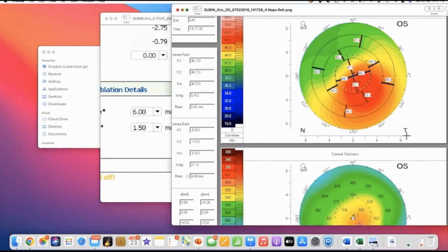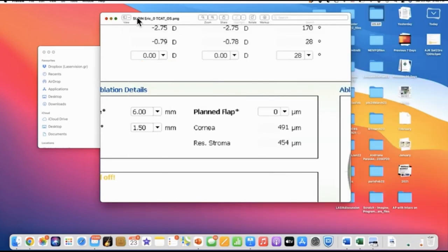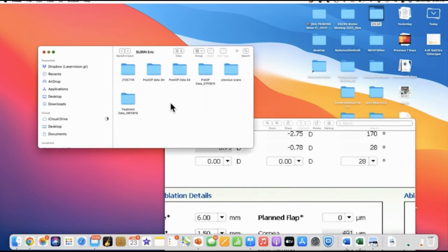How much thickness do we have here? Well, we have good thickness. We're at 473, so we have room to work. But still, because there may be a refractive surprise, even if this patient is a minus three, I will not be tempted to treat the full refractive error. Because remember what I told you, when you combine the two procedures, number one, you can get a lot of flattening, and we'll see how much flattening he got. Number two, once the cornea is normalized, you have an idea what the real refraction of this patient is. Right now, you're getting something that's dynamic and may not be true.